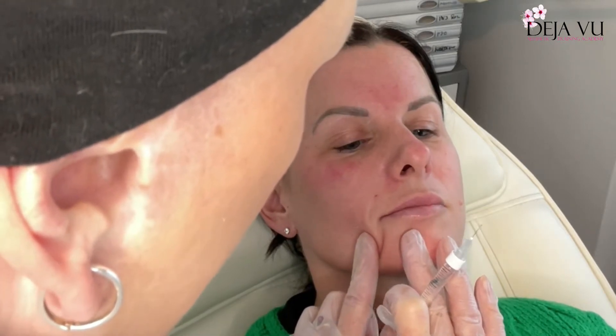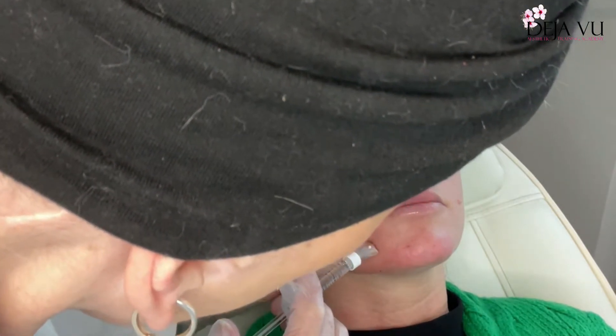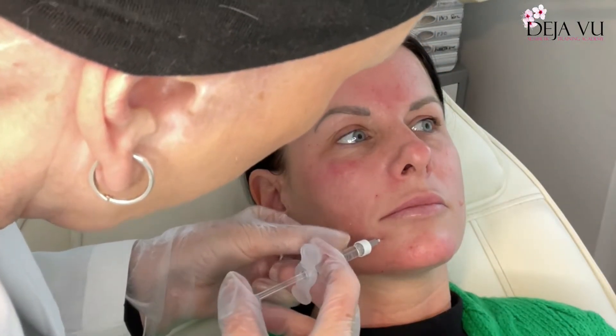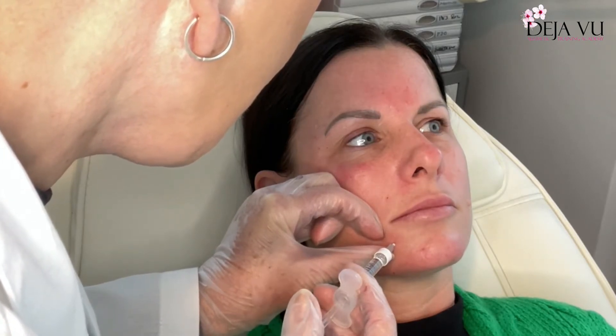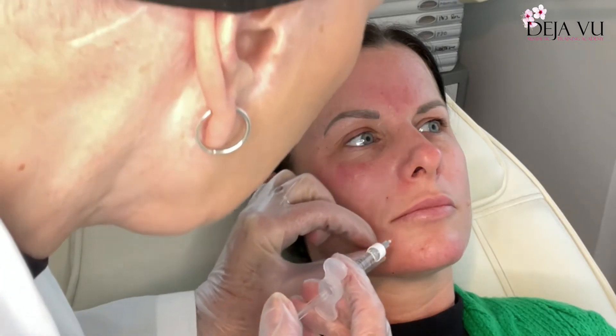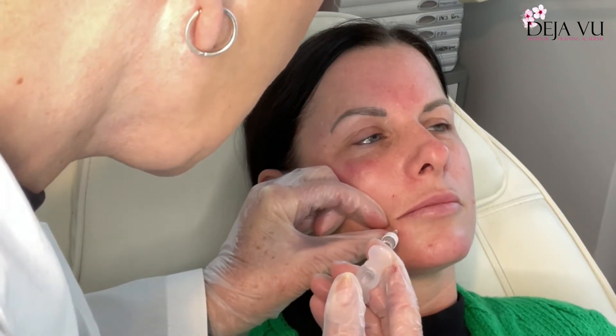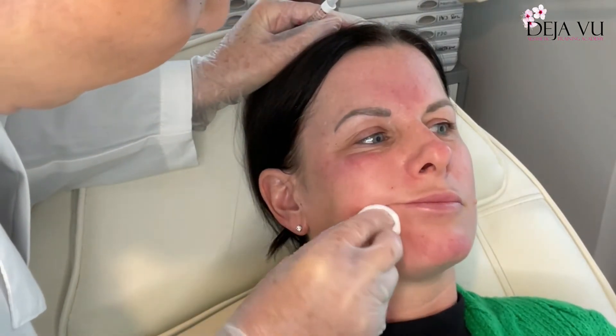Now I'm going on to this area. We need to see where there's a depression, where there's a lack, so I'm going to inject in there — aspirate, remember, and inject very slowly. Come out slowly. I'm going to go in here as well just to try and raise this corner — aspirate. I just want to merge this up as we go.